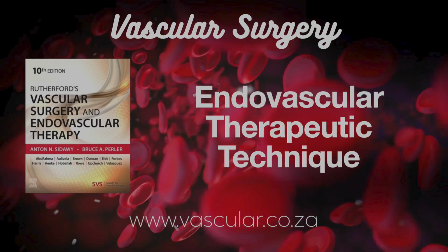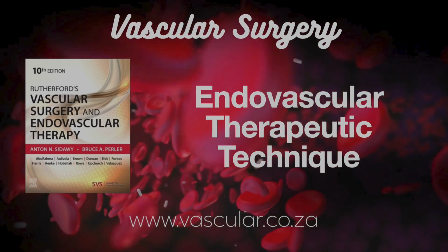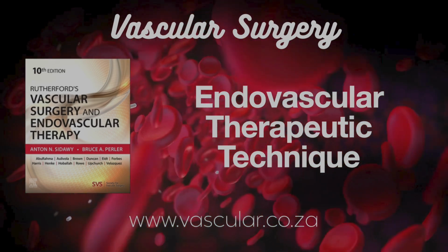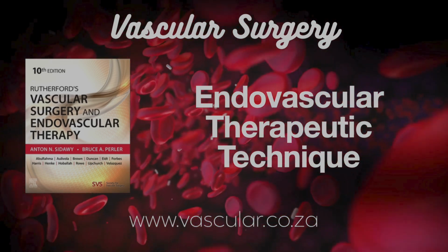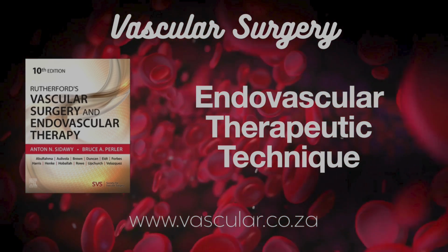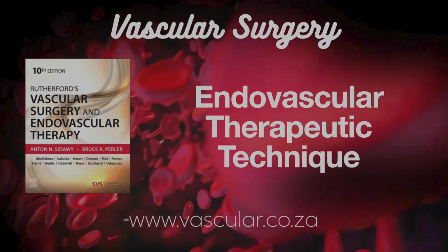Now, the source classifies stents. What are the main categories? The big classifications are based on how they're deployed. Balloon expandable stents, BES, or self-expanding stents, SES. Then you can classify them by material and design. Bare metal stents versus covered stents, which are also called stent grafts or endografts. Materials: steel, nitinol. Bare metal can be stainless steel, nitinol, cobalt, chrome, or other alloys.